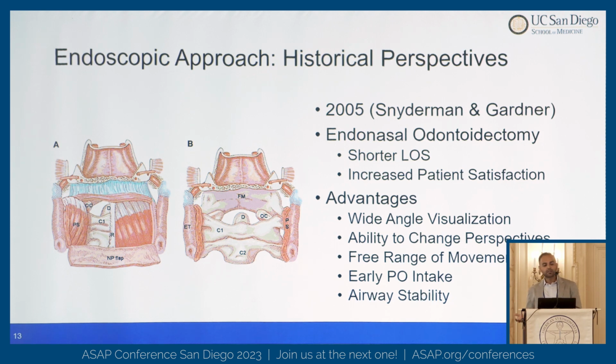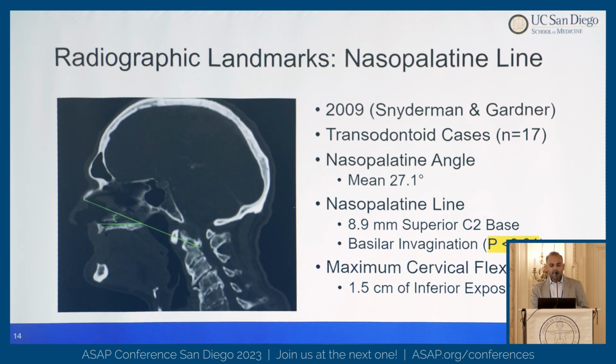You get the ability to work together with your neurosurgery colleagues and really can see exactly what you're decompressing in this area. Following surgery, many of these patients do quite well. They're able to feed immediately after surgery. There's no airway concern. So a lot of positives came out from this initial data. And then as we came to understand this pathology over the last several years, they published their series to understand how we can predict which patients are the best possible candidates for an anterior decompression.